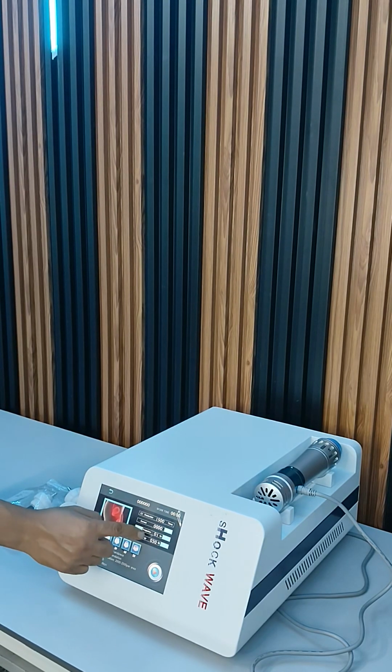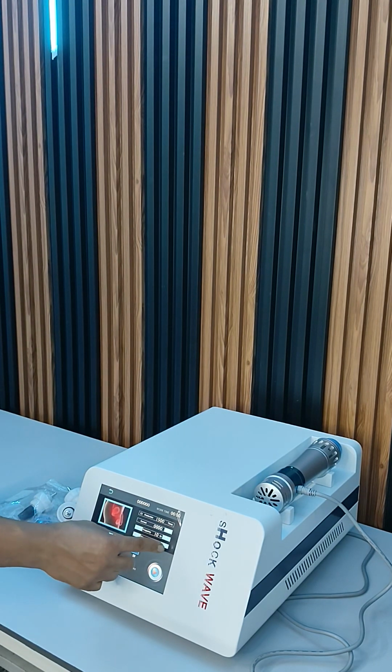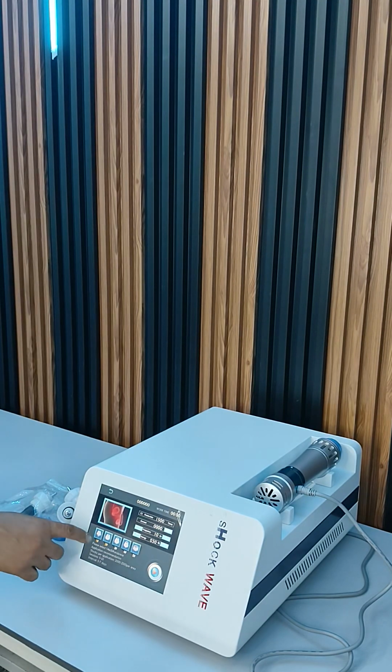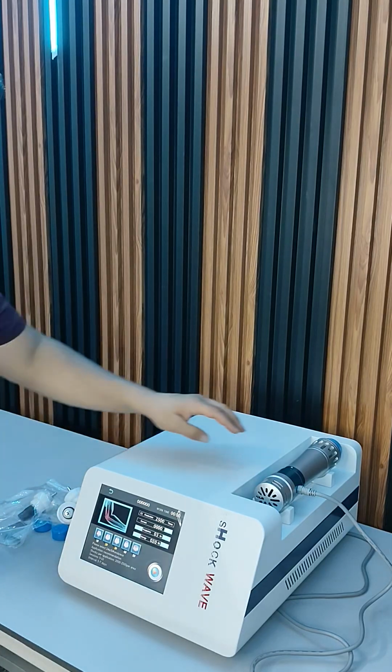If I increase the frequency 3, 4, 5, 6, 7, 8, 10, I can go up to 10 Hz in the ED, because this is recommended. You can't go beyond that, and the maximum energy here is 30 millijoule. So in the ED, we can go from 1 to 10 Hz, with energy of 5 to 30 millijoule, and the recommended handpiece is this. Now I will show you the demo.